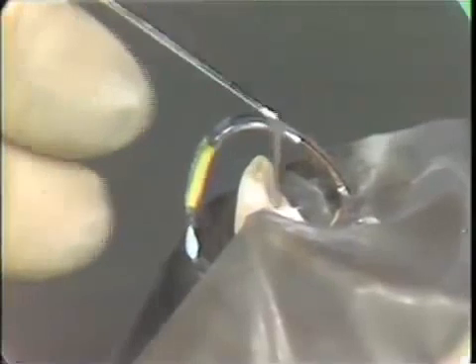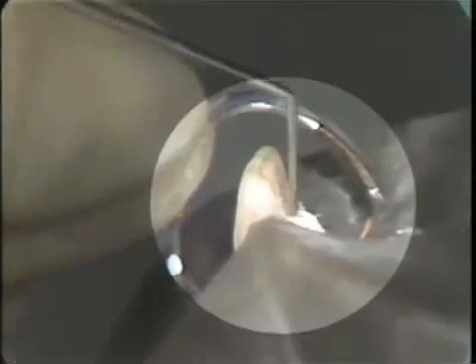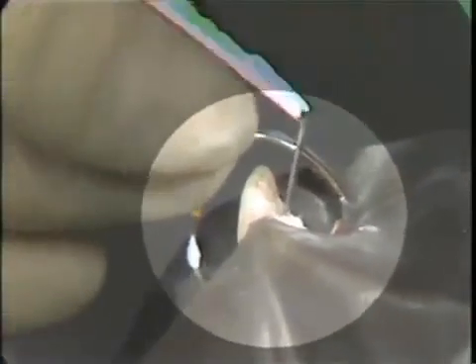With my endodontic explorer, I'll go down and check. Yes, I can get access into the pulp chamber. Come around. Feel smooth in all directions. I can feel fairly confident that I have removed the entire roof of the pulp chamber.